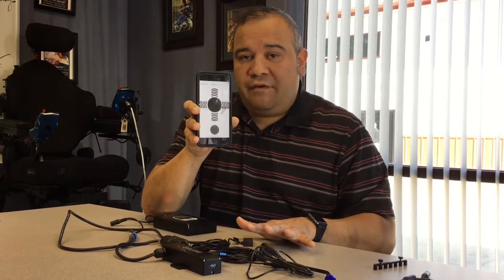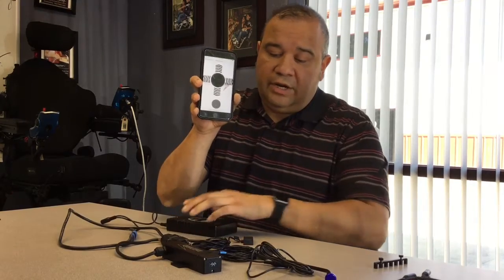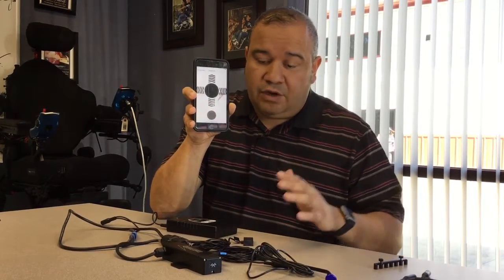We eventually fixed the problems on the chair and were able to do the assessment. But we had already figured out what the driver controls were going to be. So again, no chair here — I'm able to see what it is and what functions.